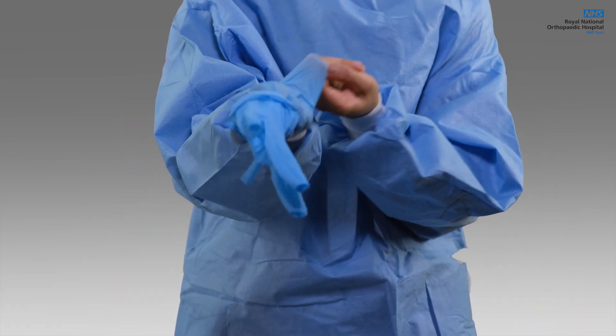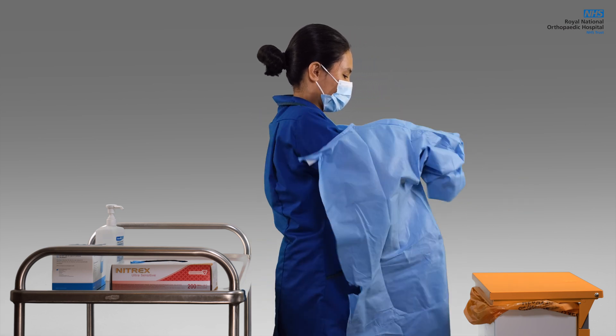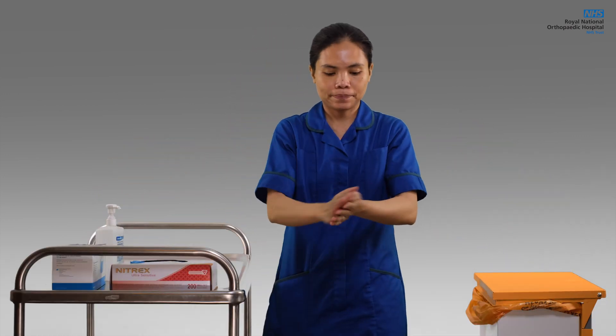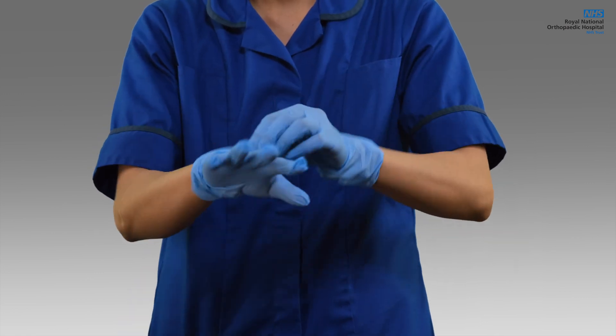Take your gloves off. Sanitise your hands, then take your gown off. Sanitise your hands and remove your face mask. Sanitise your hands again, then put on another set of fluid-resistant surgical mask and gloves before cleaning the unit.